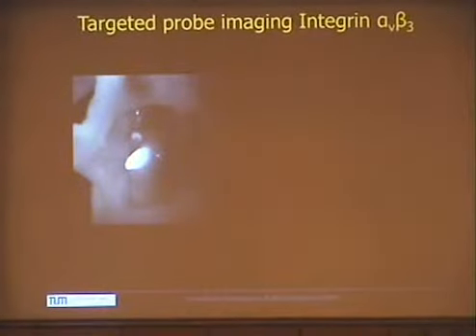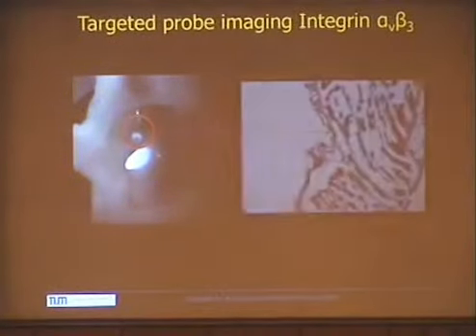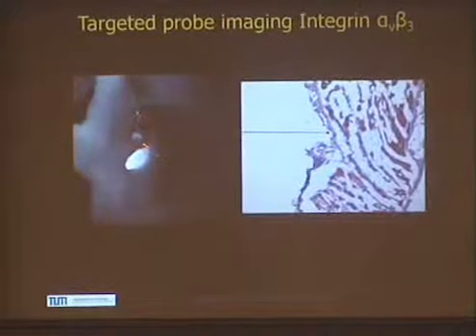And so histologically analyzing this, we found that there were cancer cells. And again, this is the idea of fluorescence. It's not based on resolution necessarily, but it's based on specificity. So even if the resolution here is not microscopic resolution, you still get a signal that could be indicative of cancer. And maybe you can even go with a confocal microscope and do in vivo high resolution imaging. But the most important thing is to have these pointers on the fluorescent signals to know that there may be something more there.